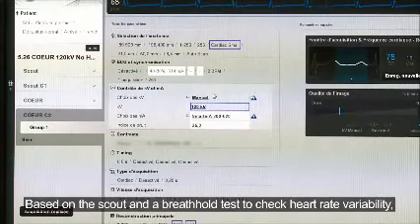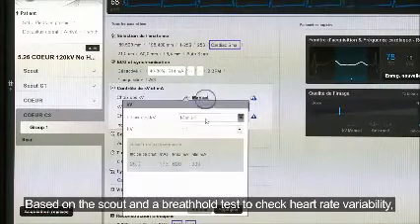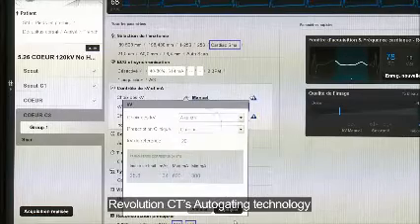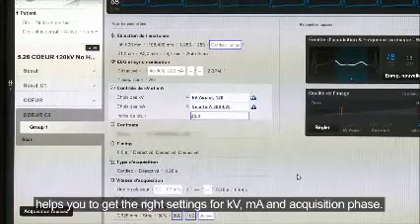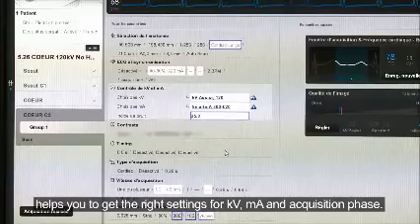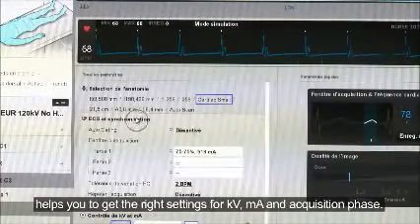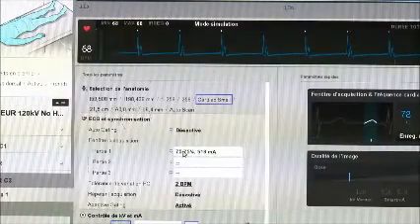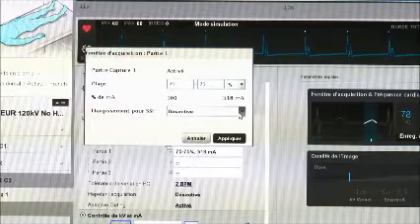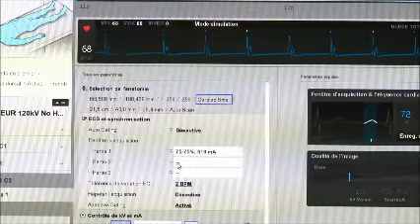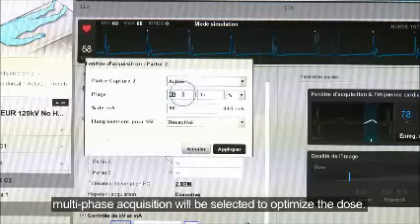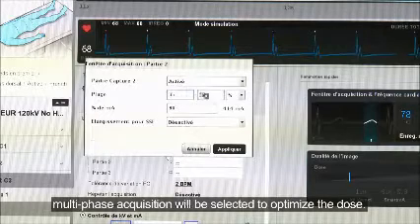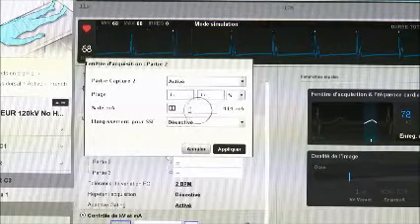Based on the scout and a breath hold test to check heart rate variability, Revolution CT's autogating technology helps you get the right settings for KV, MA, and acquisition phase. For patients with unstable or high heart rate, multi-phase acquisition will be selected to optimize the dose.